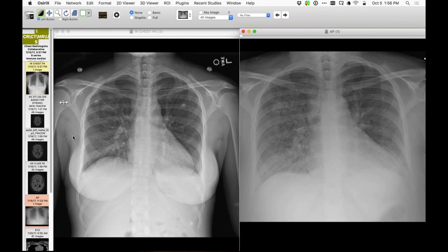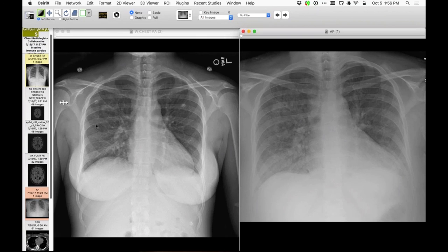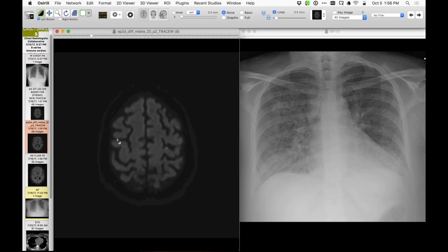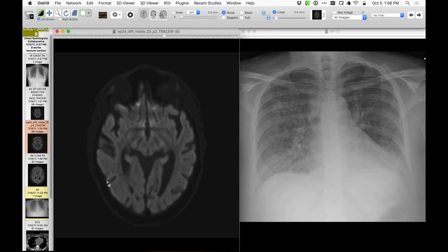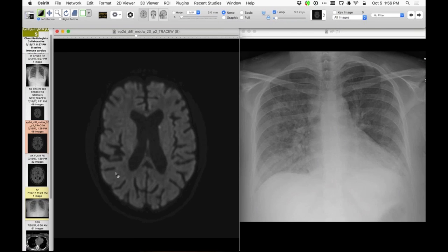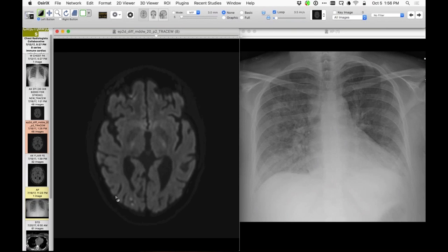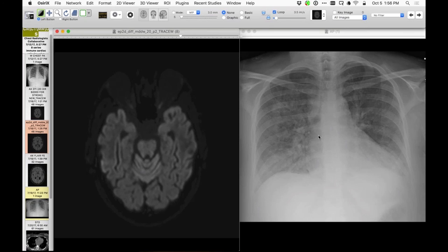I'll withhold a little bit of information. She developed some symptoms, I think, after a presumptive diagnosis was made, related to her nervous system. And she had findings there consistent with, particularly on a diffusion restriction series, embolic phenomena. So we have hyperintensities on the sequence, subcortical related to the occipital regions, the left frontal region right there, the parietal region, certainly consistent with an embolic phenomenon. So around about here, I think she did have hemoptysis, and she was diagnosed on the basis of that and some other things with systemic lupus and hemorrhage, as well as the findings you see on the brain MRI.